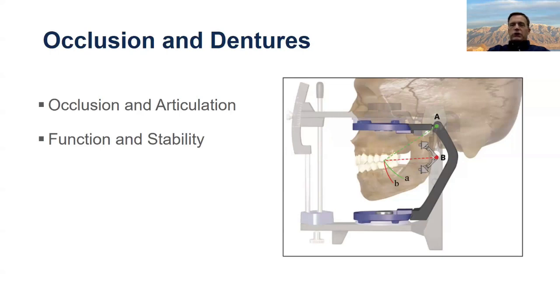As you guys know, edentulous and dentate patients tend to articulate differently. Denture wearers tend to chew horizontally with only a slight vertical component, while dentate patients tend to chew in a warped teardrop pattern with much more vertical movement. So because of this different jaw movement, we definitely have to have a different occlusal scheme.